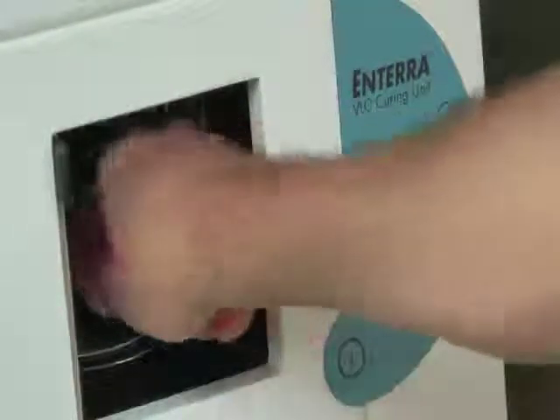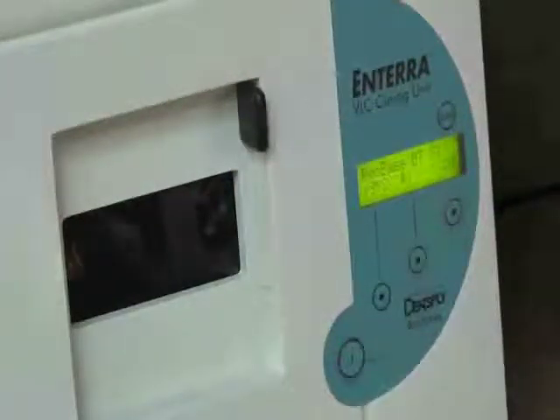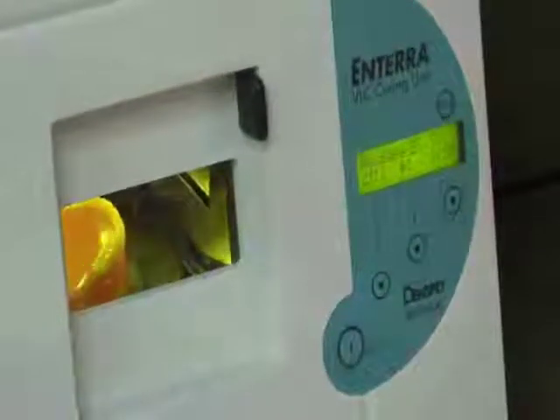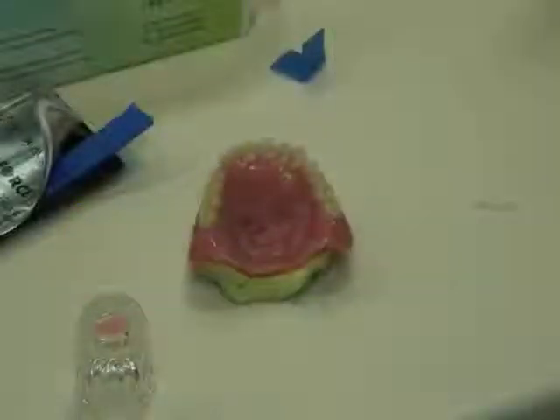Any light curing unit can be used to cure Fiber Force. Light ovens, such as the one shown here, can also be used. Simply place the appliance in the unit for the recommended period of time, which will vary between one and five minutes.